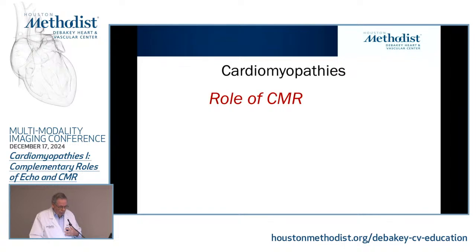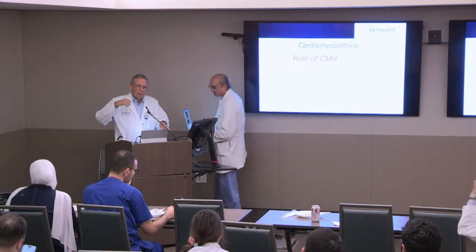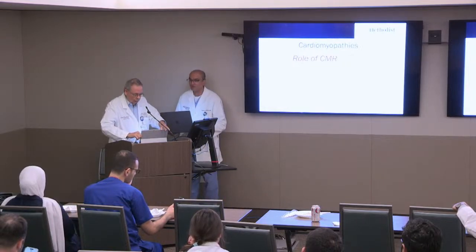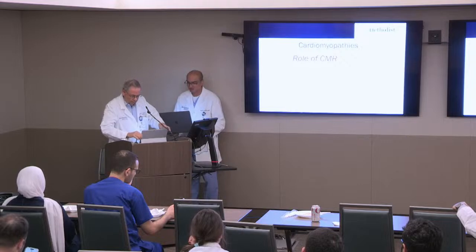So with that intro, we're going to have Dr. Shah tell us all about how CMR can help us today with myocarditis and dilated cardiomyopathy, and then the second session with the infiltrative diseases, accompanied also by the evaluation by PET.